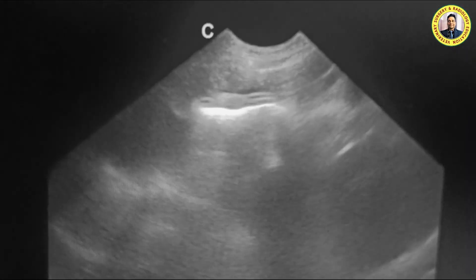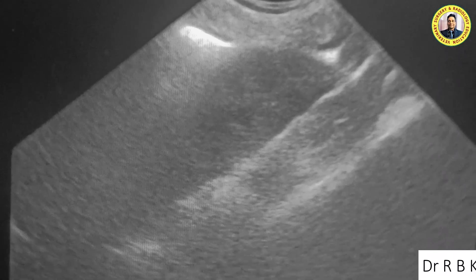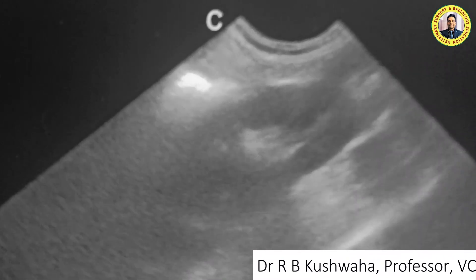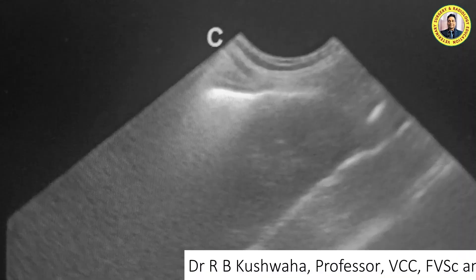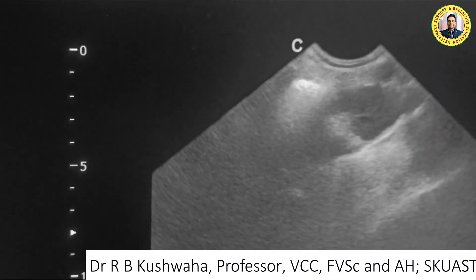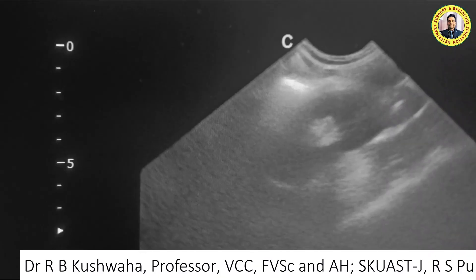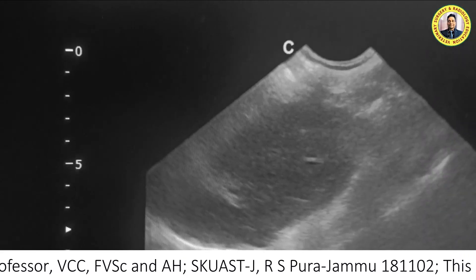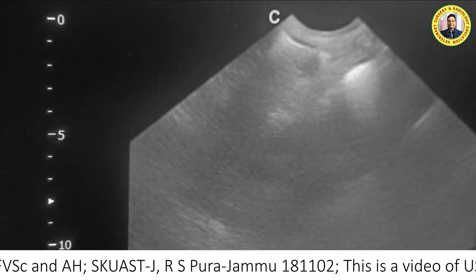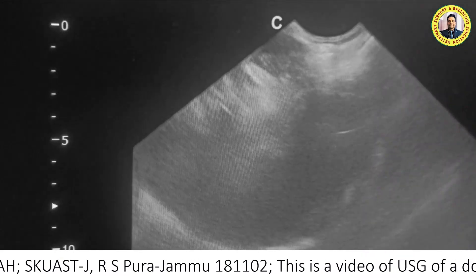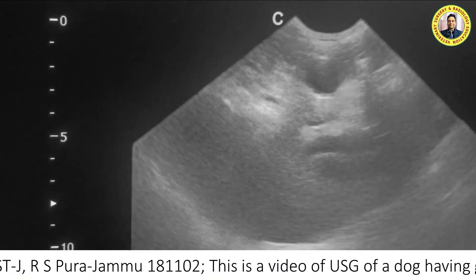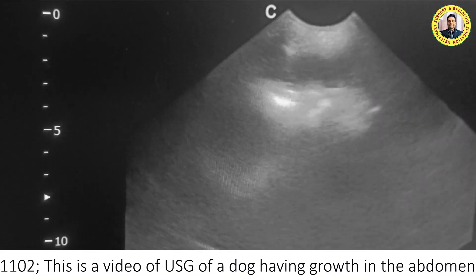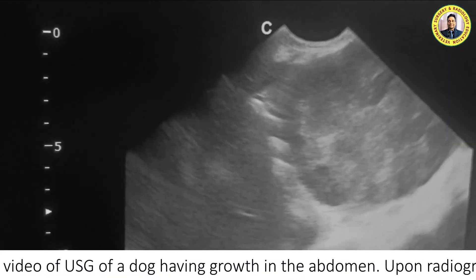If you go down, you can see the right kidney. This one is the right kidney — the picture will be more clear when we scan with the linear transducer. The size of this kidney appears normal. There is a fat pad attached with this kidney. The liver appears to be normal.